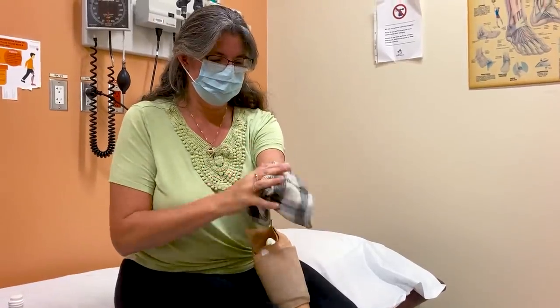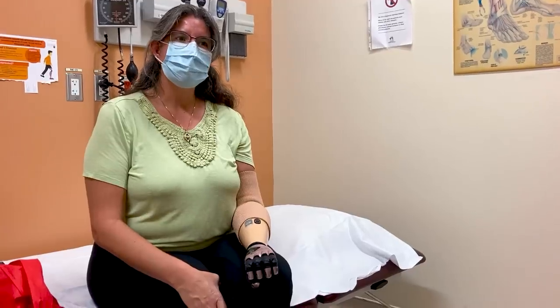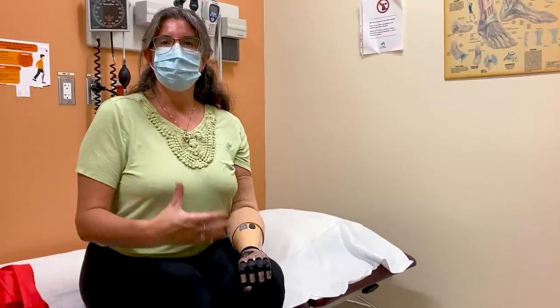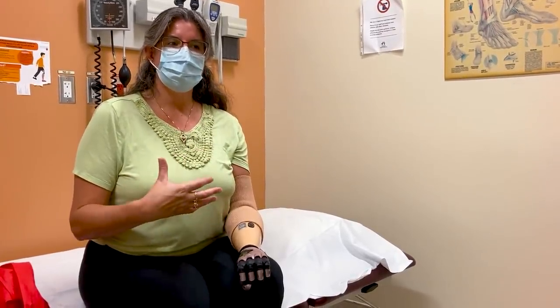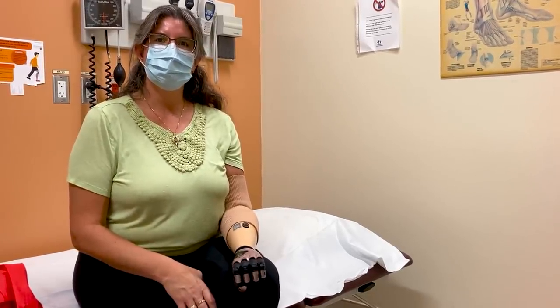Now I want to introduce you to Tracy. She's a woman who was born with a congenital limb difference where her left arm didn't develop in a typical way. As a child, she wore a prosthetic for a short time, but then she hasn't been wearing one for about 40 years. They were heavy and a lot more awkward than they are now. And you can imagine that causes asymmetry to the body, and recently she's been developing back pain, so she's now wearing a myoelectric device. It has made a huge difference because I was having a lot of back pain, so even just having it on at my desk, if I'm not fully functionally using it, it helps with the back pain, and I've noticed a big difference.